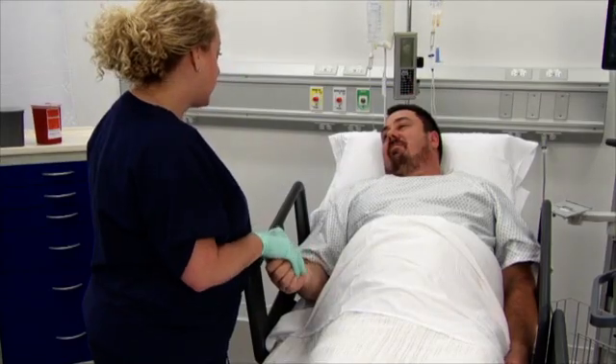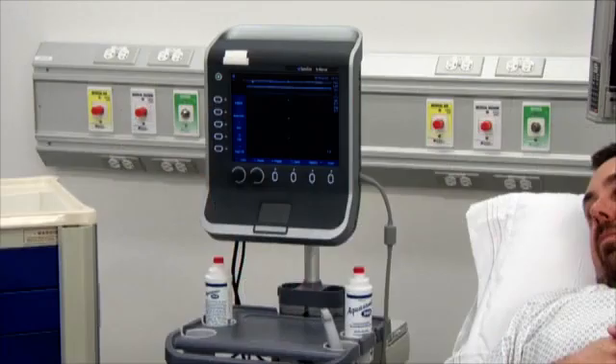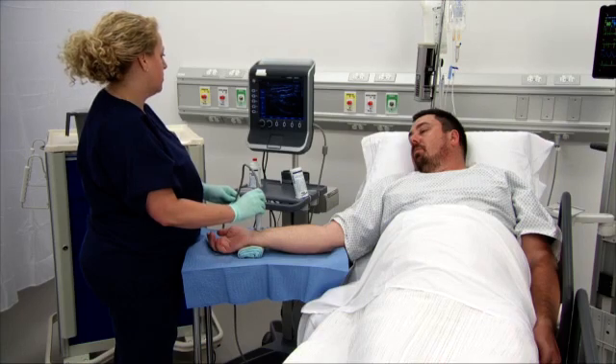Prior to insertion, adjust the bed to the proper height and ensure that the ultrasound machine is in the proper position and easily accessible. Perform a vessel assessment using ultrasound. Using the probe, assess the intended insertion location for the optimal insertion site.